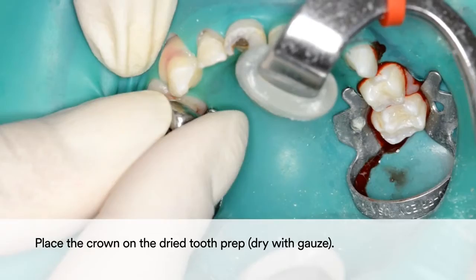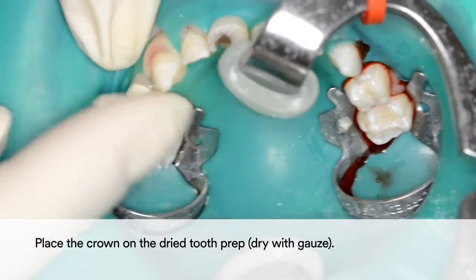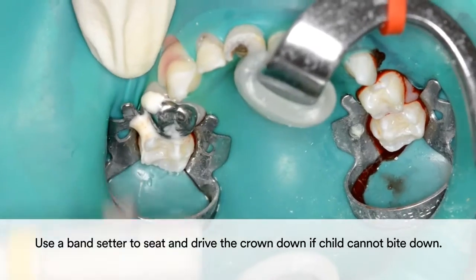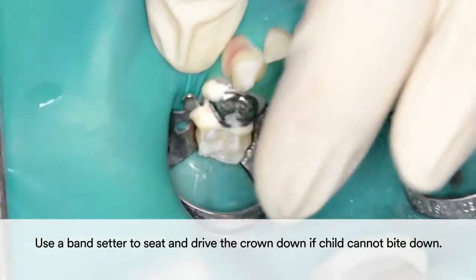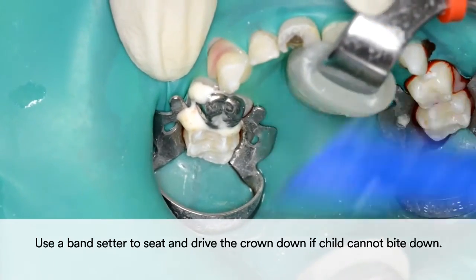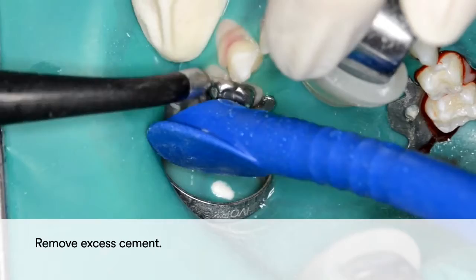Then dry the tooth preparation with gauze and place the crown. If the child cannot bite down, use a band setter to seat and drive the crown down. Finally, remove excess cement and the restoration is completed.